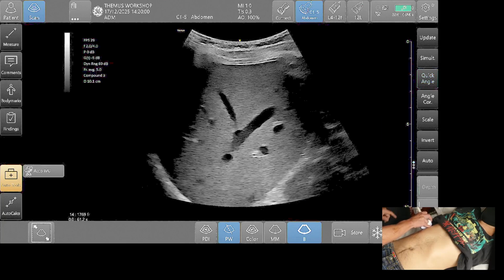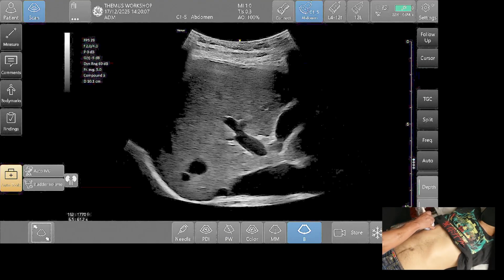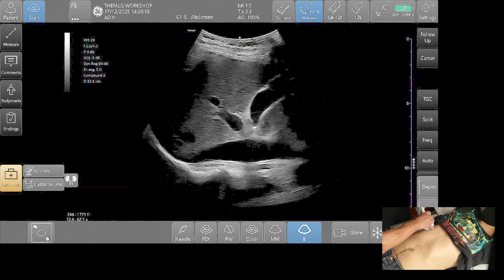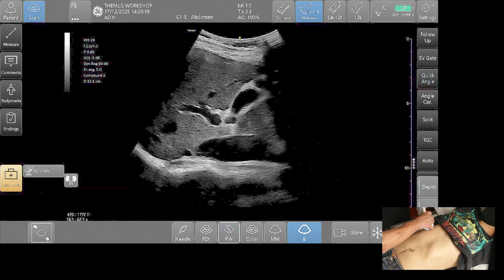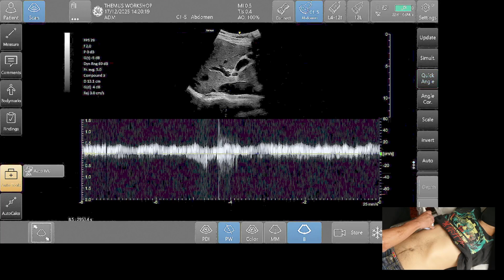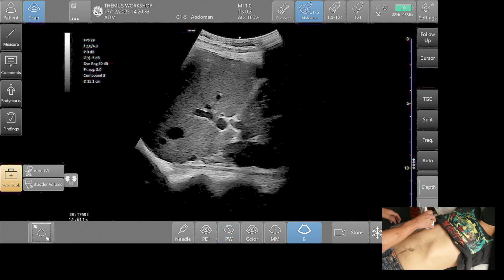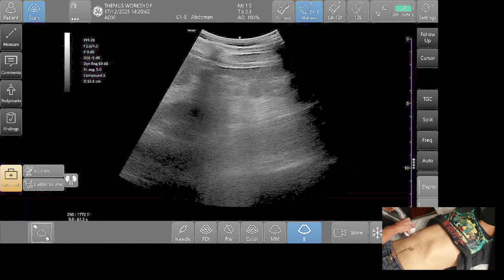Then we go to the next target, tilt your transducer, and then you will find the portal, right? Portal vein is also bigger compared to left umbilical portion. And in this direction, the vessel is coming to your transducer, make the sampling much easier to spot. In this view, you can see nicely the portal vessels, right? The variation is so small. If you ask the patient to hold the breath, the view is even better. But I think in daily practice, we will not ask the patient to hold the breath all the time. So the best way is to find the beautiful view for us to spot.